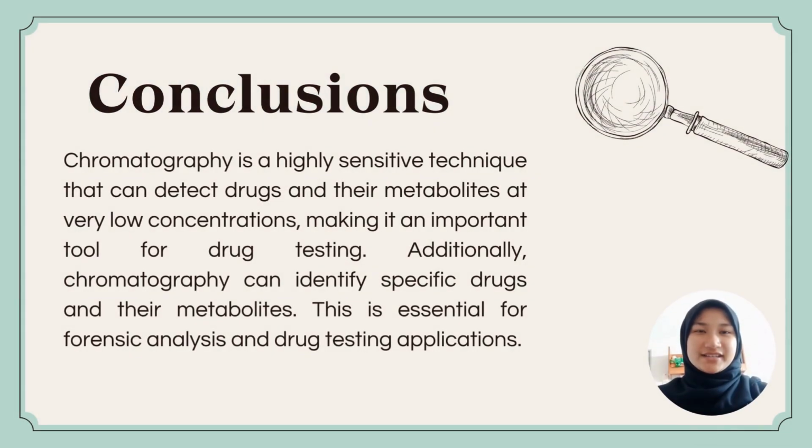Chromatography is a highly sensitive technique that can detect drugs and their metabolites at very low concentrations, making it an important tool for drug testing. Additionally, chromatography can identify specific drugs and their metabolites. This is essential for forensic analysis and drug testing applications.